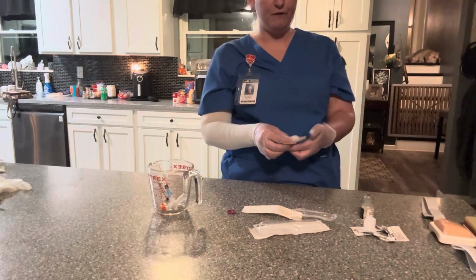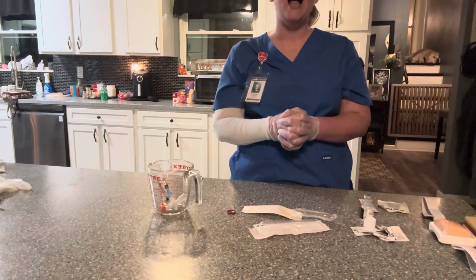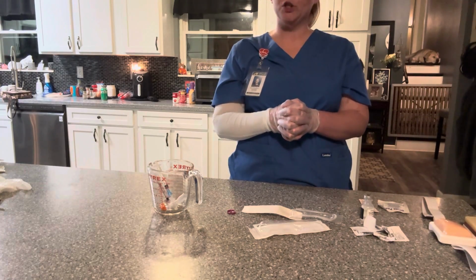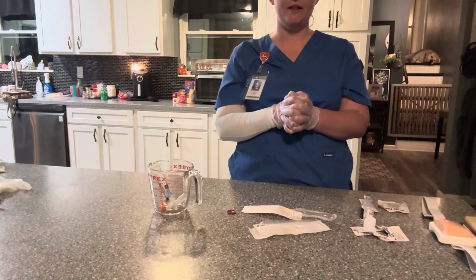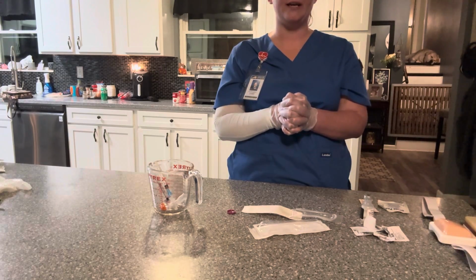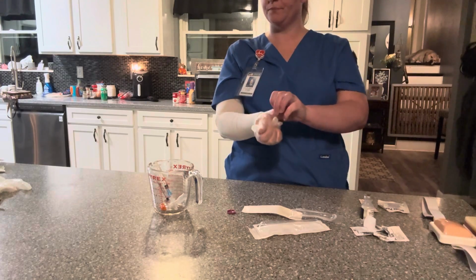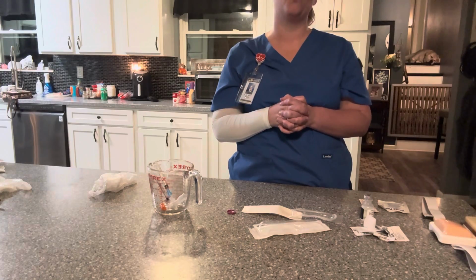I would let both of those sites that I cleansed before giving the injection air dry. I would not fan them or blow on them. After giving my medication, I will note the correct time and date, the correct medication, and the correct site. I will remove my gloves, wash my hands, report and document.